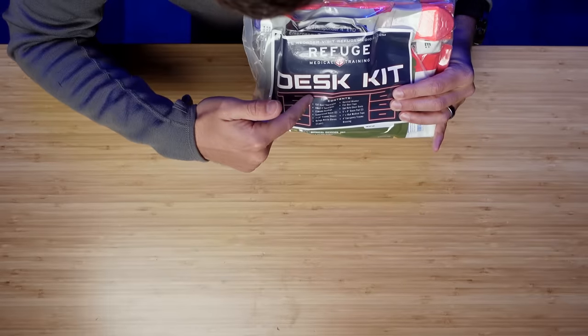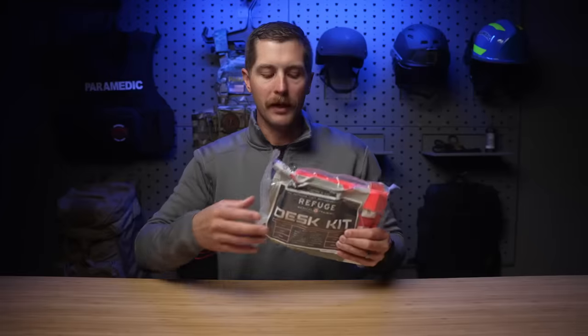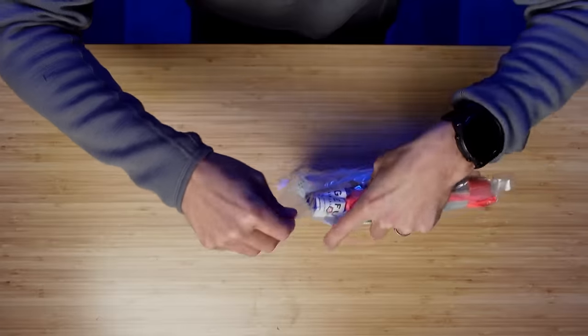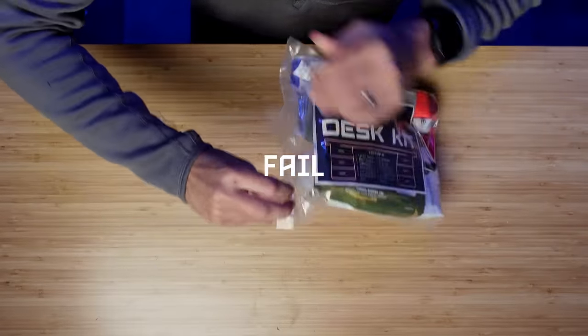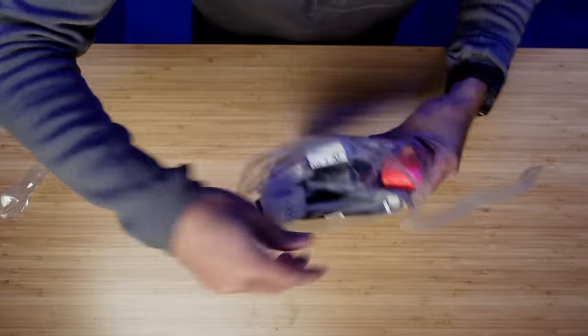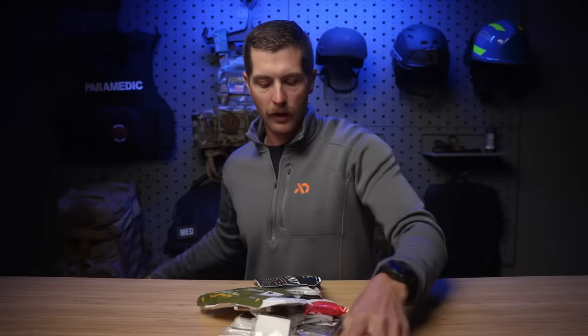So we are going to open up this kit and go through piece by piece. Obviously it is vacuum sealed on the front — you have everything that is in the kit so you can kind of see what you're getting as you open it. This thing is decently sized but it will fit in a lot of different areas. We've got two pull tabs, and I think those are the only two on the kit. One problem with vacuum sealed kits is that there's no organization, so if you're trying to get one item in here, everything's going to come out. You could also buy this as a refill kit and put it in a nylon bag of your choosing. So we're going to dump everything out on the table.